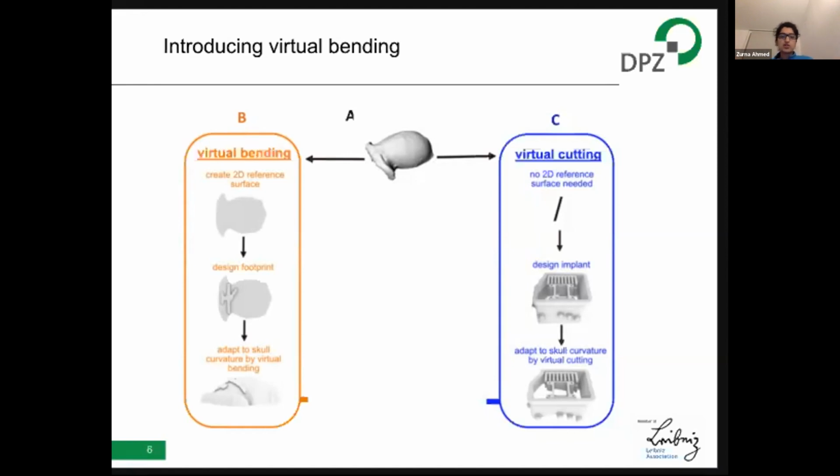So for this, we also introduce on top of it the virtual bending approach. Just to briefly describe it because of time reasons: what we do here is we project the 3D extracted skull surface to a 2D reference surface.